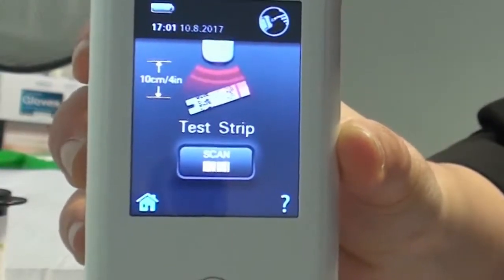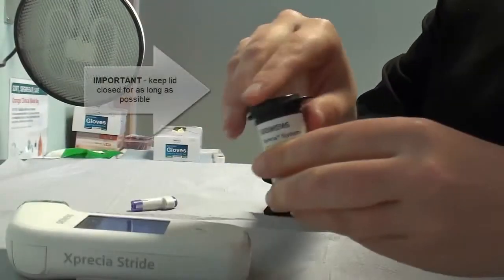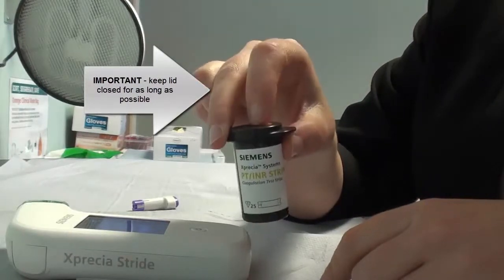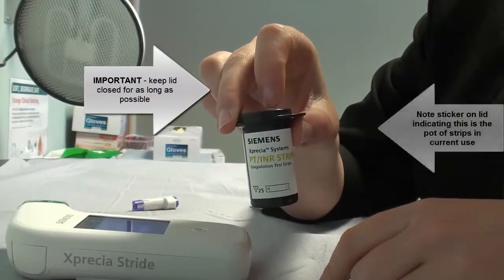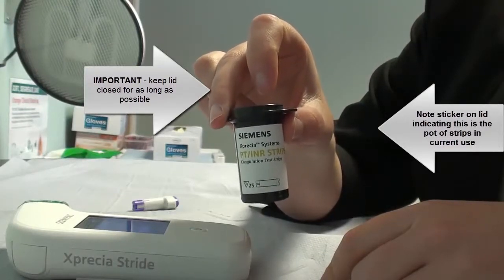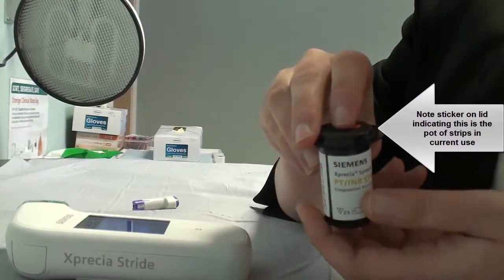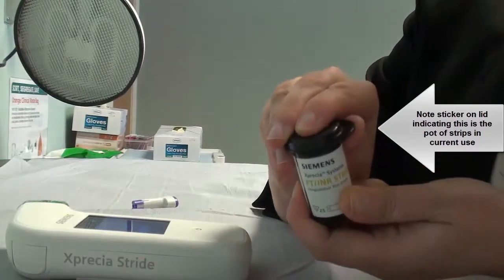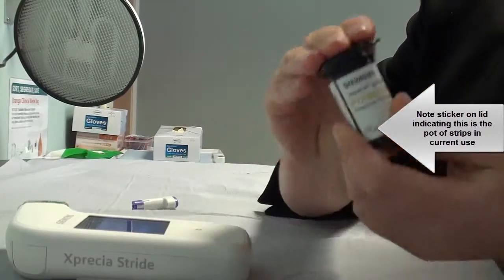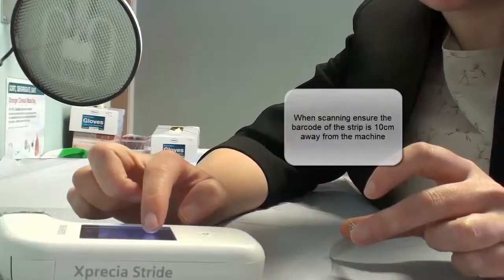So what I'm going to do now is I'm going to scan our test strip. It's really important when you take the test strip out that you keep the lid of the pot closed for as long as possible. The longer the strips are exposed to air, the more likely they are going to become affected by the atmosphere and error results will ensue. So quickly replace the lid on that and press scan.